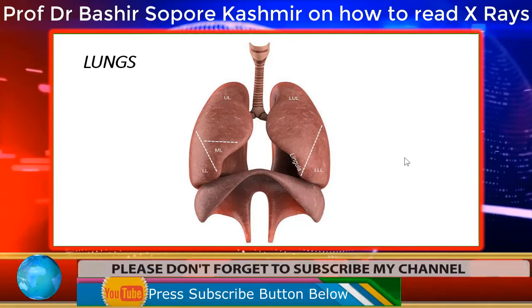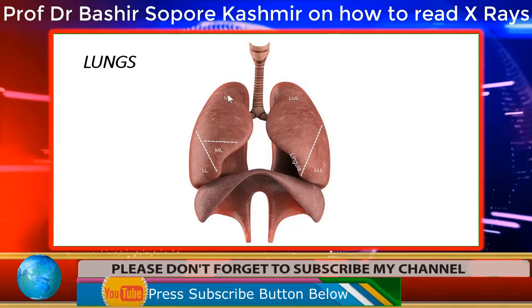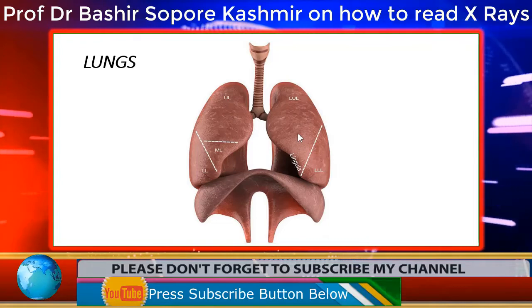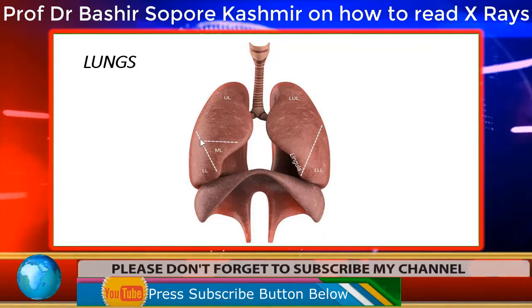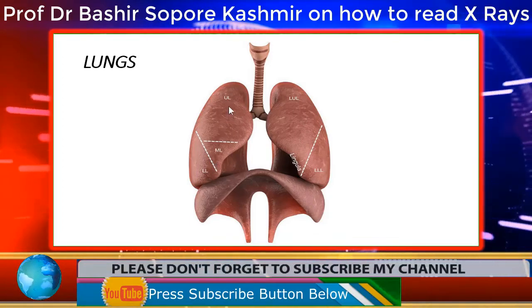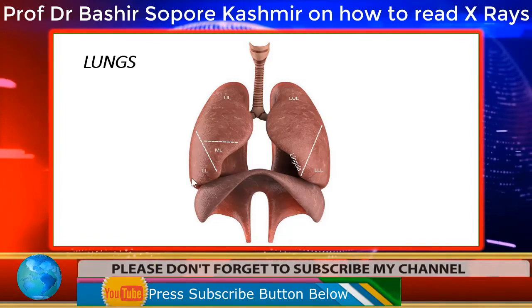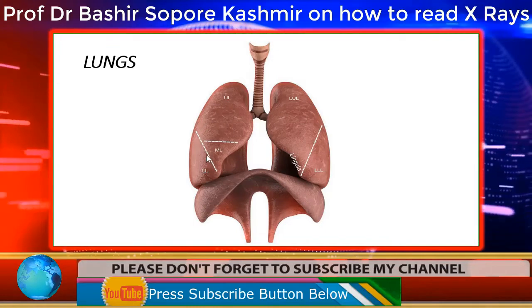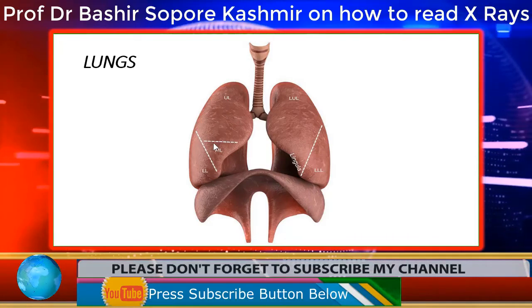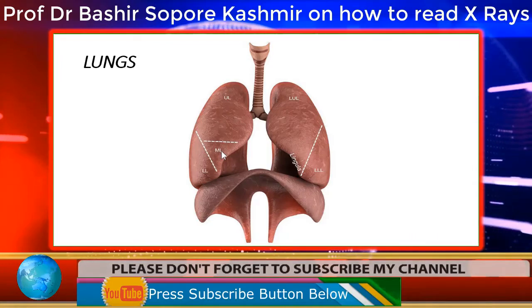Now, if I show the image here of the lungs, this is the right upper lobe, this is the left upper lobe, this is the oblique fissure here, which divides the upper lobe and lower lobe. There is also a horizontal fissure like this, and this is the middle lobe.